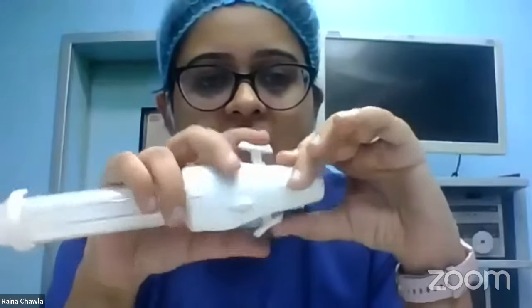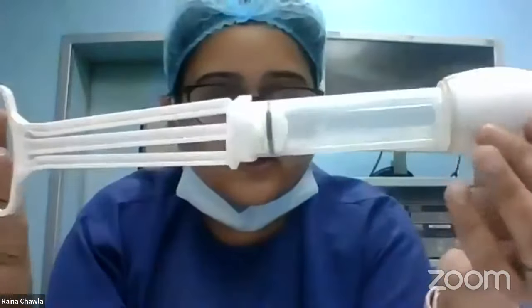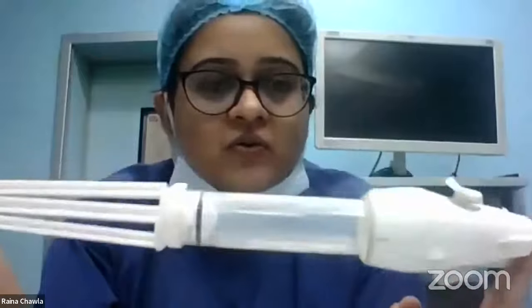Okay, see, I've pressed both the locks. One lock and then the second lock. Once I've locked this device, then I pull the plunger back, like this. Now this is called a loaded syringe.